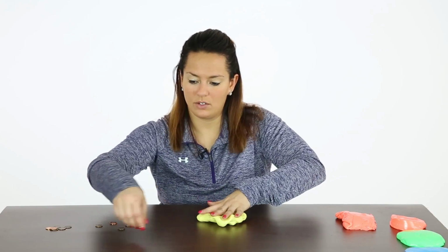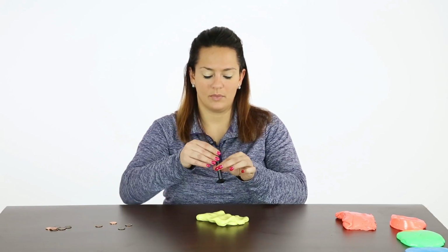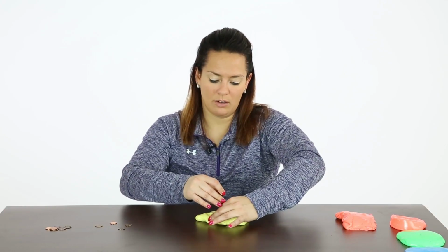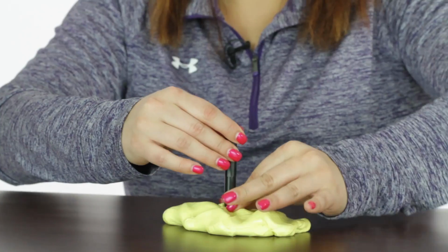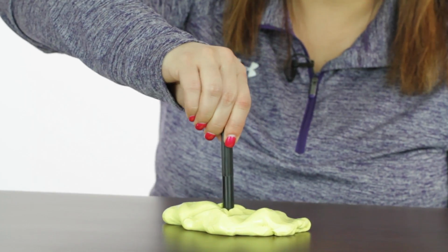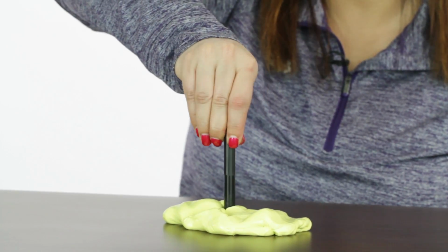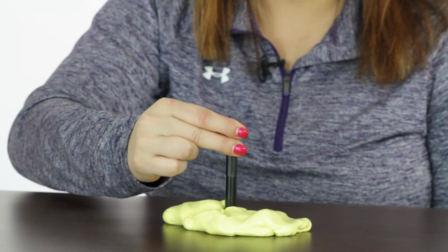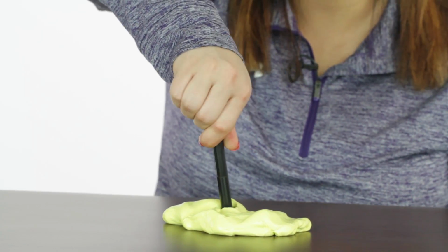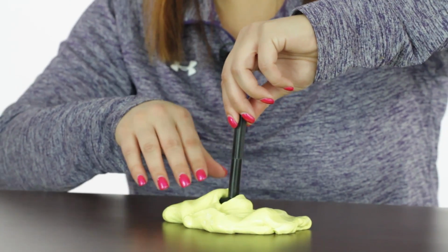We can also use some other tools such as this putty size peg turn. So we're going to push this down into the putty, kind of bury the base a little bit. And this is more of a refined grasp, such as like a radio knob, a lamp turner. Those are all things that you need more of this peg turn hand strength for. So I'm just turning the knob with some resistance from the putty down in there. Again, you can use two hands, so I'm going to pull it out.